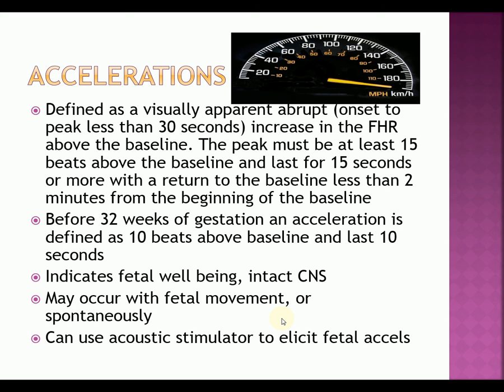Accelerations, we love them. They indicate fetal well-being. They indicate we have an intact central nervous system. The baby's able to move around. The central nervous system says, hey, we need more oxygen, therefore the heart rate increases, and that's why we see accelerations. A lot of times they occur with fetal movement, but they can also occur spontaneously. You can use an acoustic stimulator to elicit fetal accelerations if you have a patient on the monitor and you're not seeing any and you'd like to see them.